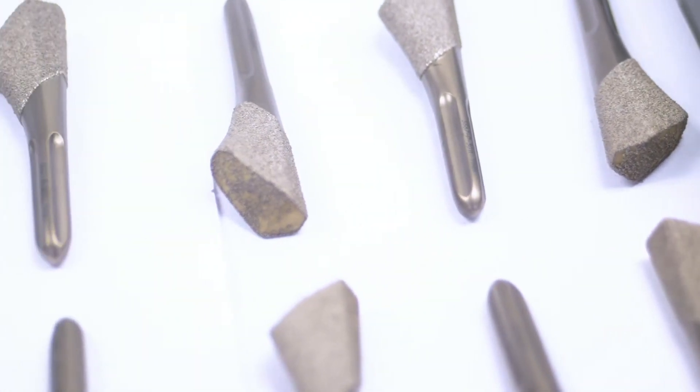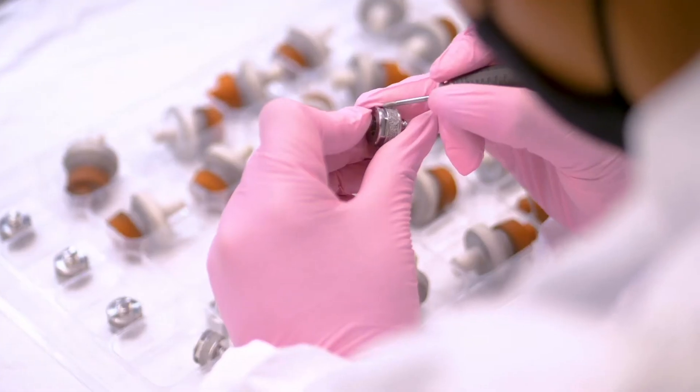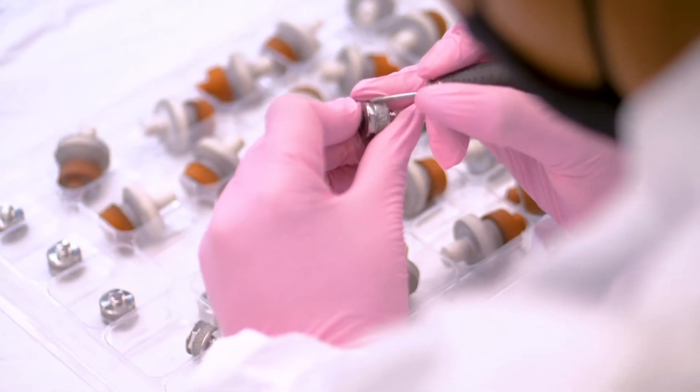The coating that we spray is porous coating. So when it is implanted into a person's body, the porous coating allows the bone to grow into the implant itself. Not only does it increase the longevity of the part itself, but the person's body accepts it better.